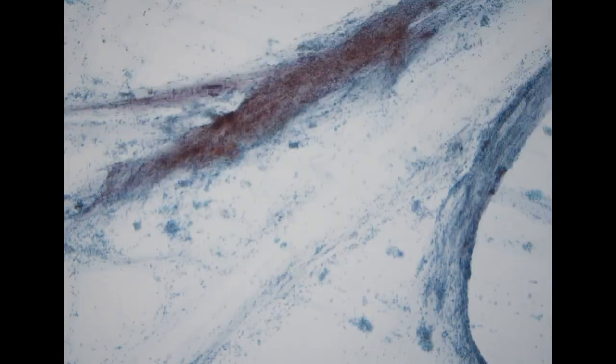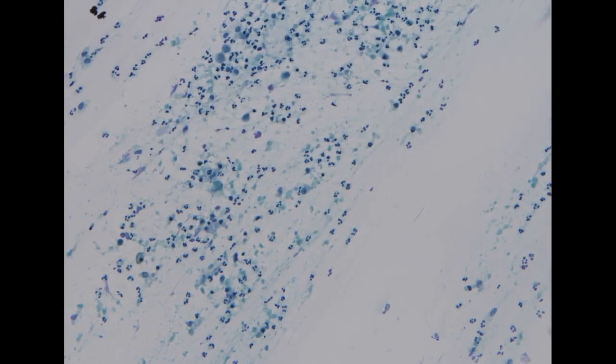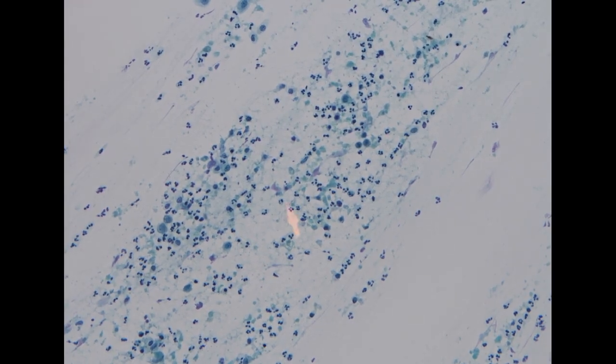So let's move to pap smear. So this specimen is from an 85-year-old female. So she is quite old, and she presents to us with vaginal bleeding. So for this specimen, definitely it shows a feature of atrophy. And because clinically she developed vaginal bleeding, it is highly likely that we will see some endometrial debris. So this is the feature of endometrial debris.